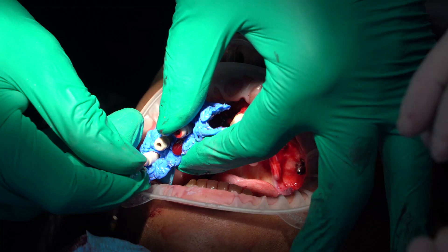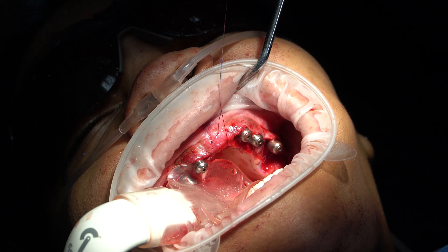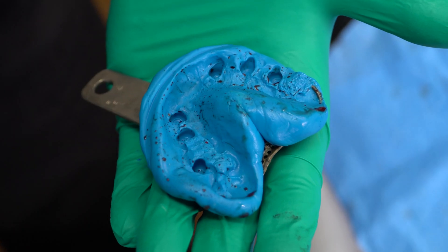At the time of surgery, we captured the implant position in a bloody field. What would have normally taken eight hours, we were able to accomplish in a fraction of that time. We'll extract the one remaining reference tooth and the artificial reference tooth. We will have the digital impression already made and sent off to the laboratory.